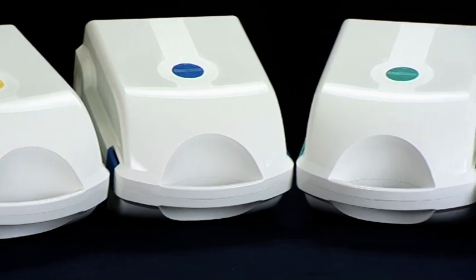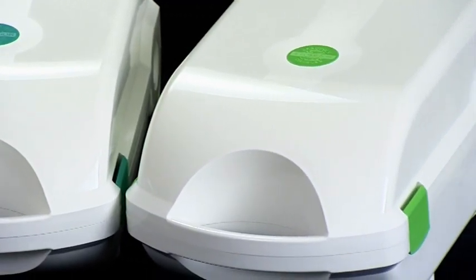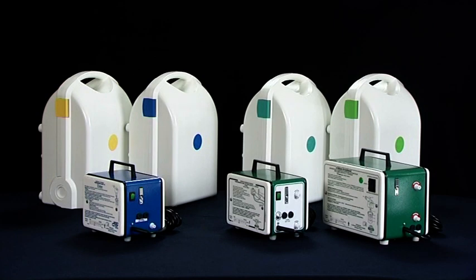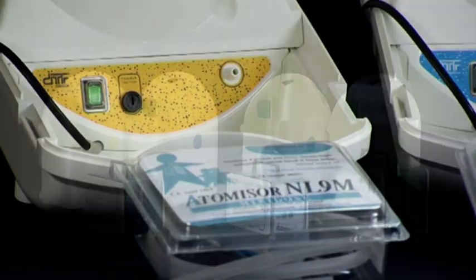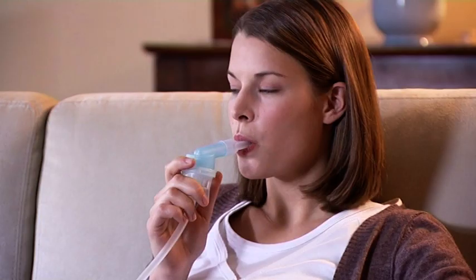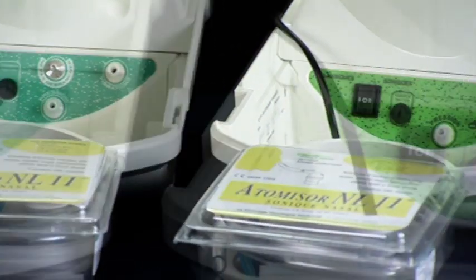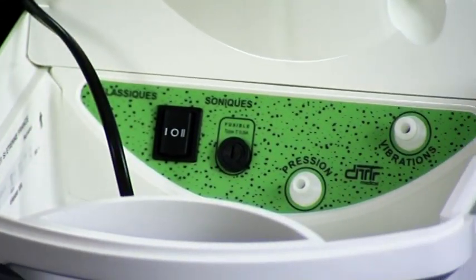You have been prescribed an ATOMISOR jet nebulizing system for a bronchopulmonary treatment or for nasal or sinusitis treatment. For a bronchopulmonary treatment, you shall use a standard jet nebulizing system equipped with a mouthpiece and only one tube. For a nasal or sinusitis treatment, you shall use a sonic jet nebulizing system operating with sound vibrations and equipped with a nosepiece and two tubes. In that case, the system alternates sounds and vibrations every 15 seconds.